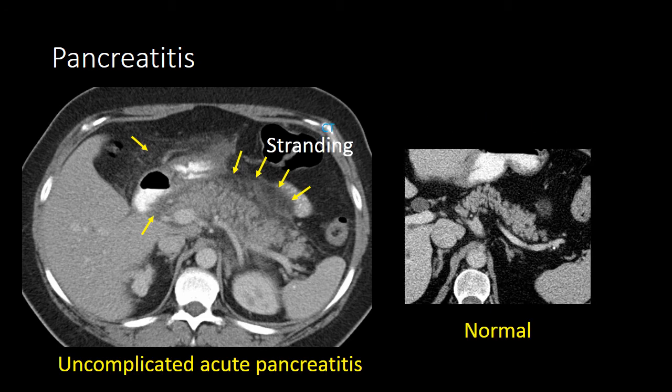This is a normal pancreas for comparison, where you can see the clean fat around the pancreas, as opposed to the fat stranding on the initial case.